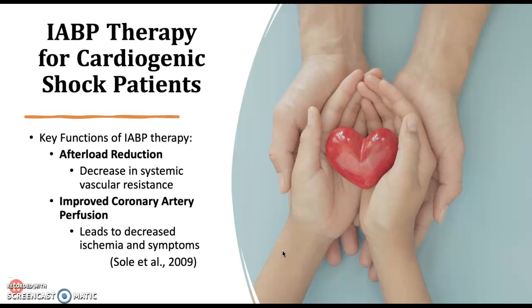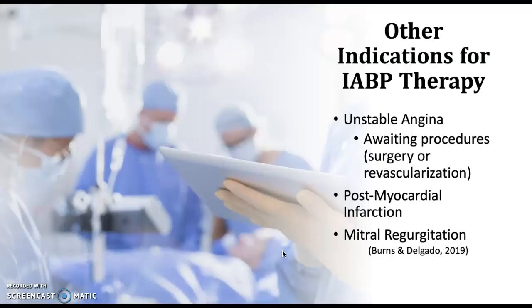So because this balloon pump therapy is able to do both of these functions, reducing afterload and improving coronary artery perfusion, this actually helps to ultimately increase stroke volume for the patient and in turn helps to increase the overall cardiac output, therefore perfusing all the tissues in the body in an effective manner.